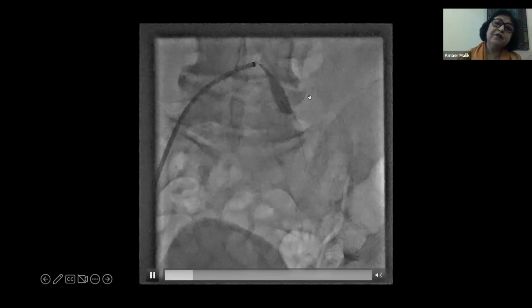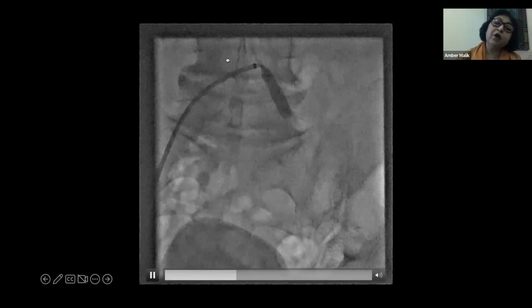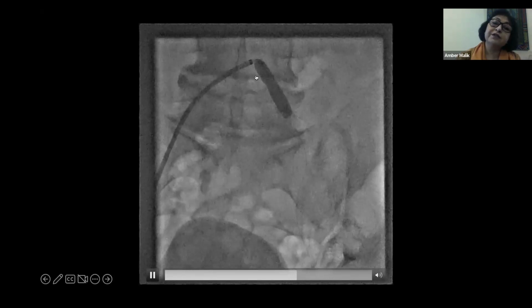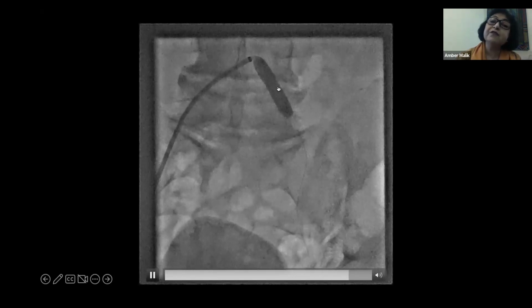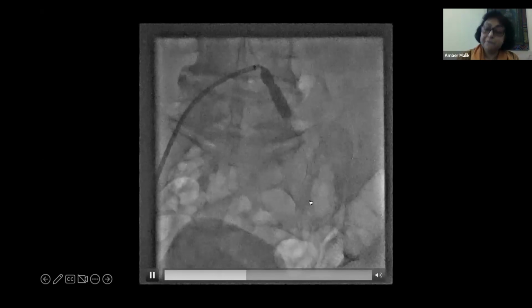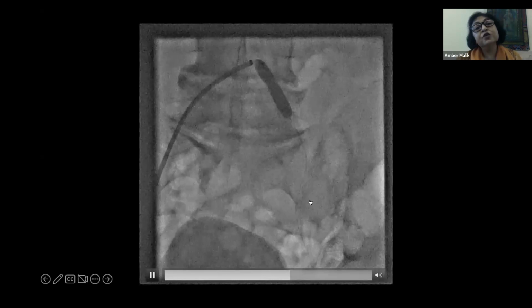The interesting thing for this is really that because there was a tight stenosis over here, one could not get the crossover sheath across it. So we opted to balloon this first, stent it first, and then get our equipment down so that we can fix the rest of the iliacs. So we've ballooned it. It was a tight stenosis here. I could not somehow upload the first picture, which actually gives a very nice picture of this.